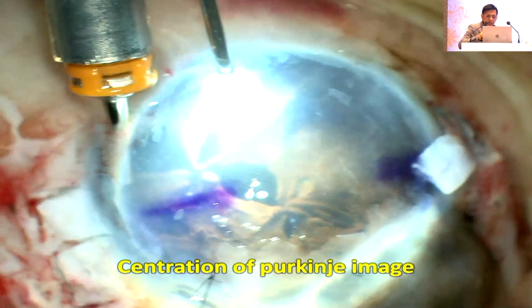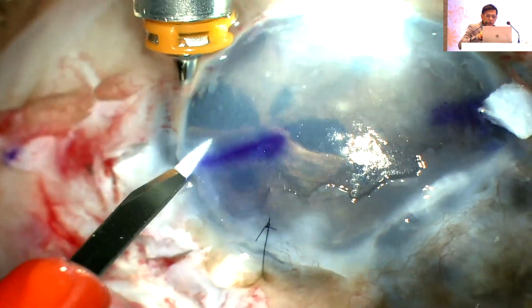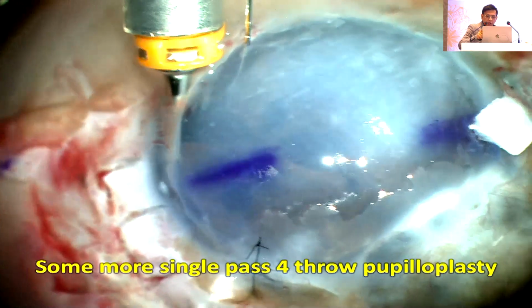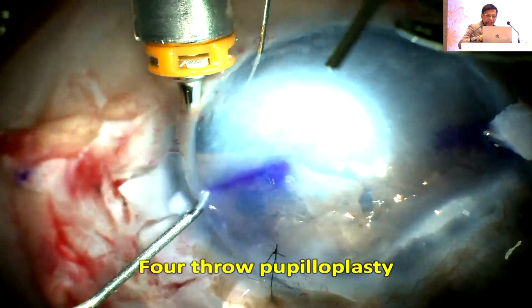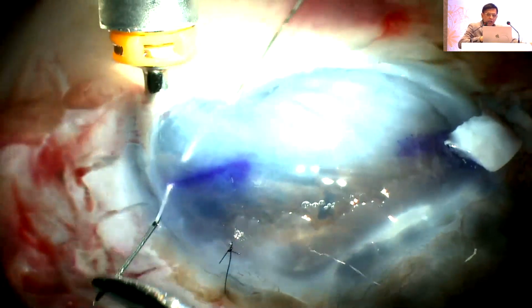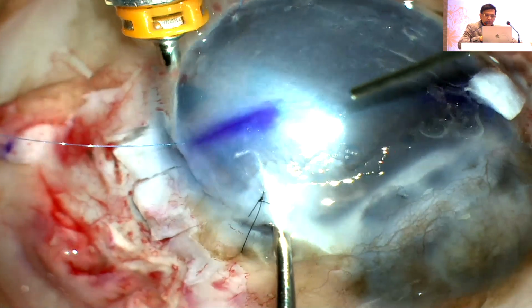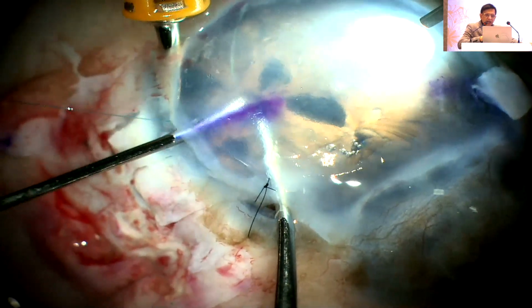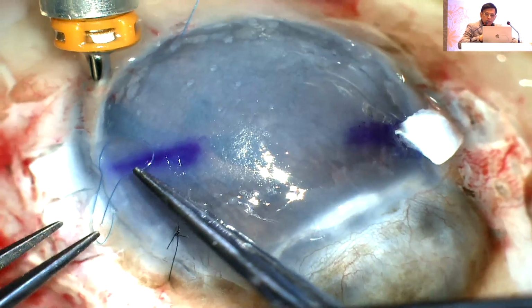Once everything is done there and my pupil is well centered properly, I'll just go in, take out my Descemet's complex. A little bit of iridectomy area is still damaged there. I would like to close it because that air will go back otherwise. And then I'll have a problem with my PDEK graft, so I don't want to leave anything behind unnecessarily. I'd like to close all these small defects also, so that no air goes posteriorly.